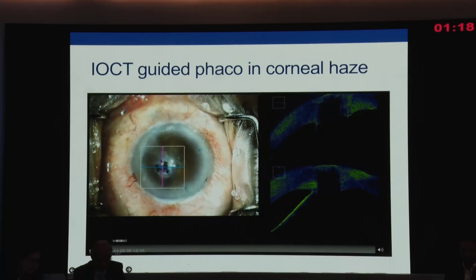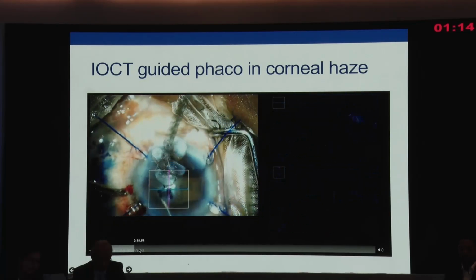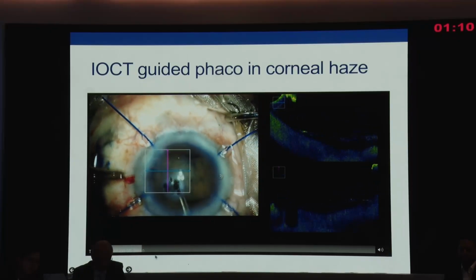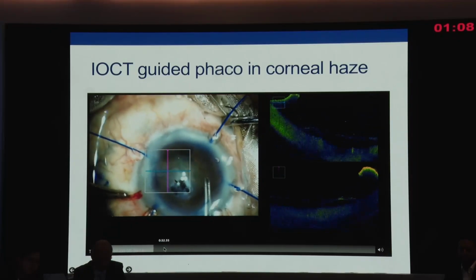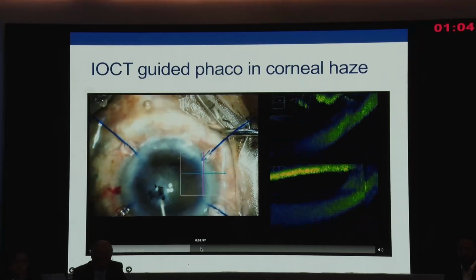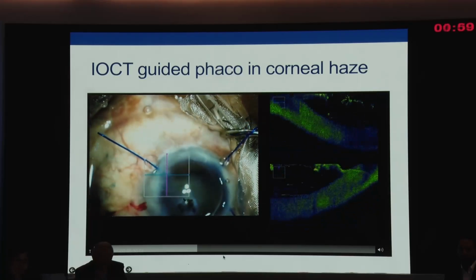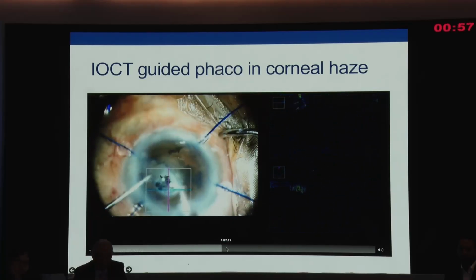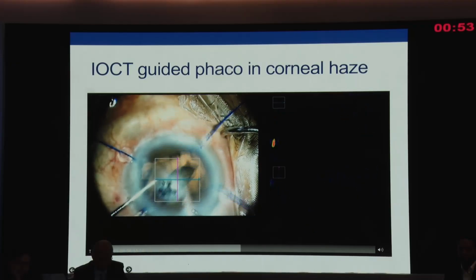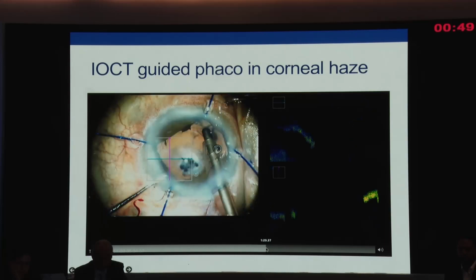Now, this is a black and a white cataract. Black because it is tattooed, and white because there's a corneal opacity. Again, notice that you have to expand your area of visualization, nylon hooks, then you have to use dispersive viscoelastic agent, then you have to do rhexis. Don't leave the edge of the rhexis here. Here, the edge of the rhexis was lost, but we could pick it up through the intraop OCT microscope. And then the same thing, phaco in situ, so you keep getting the red glow to become better and better by keep eating the nuclear fragments.